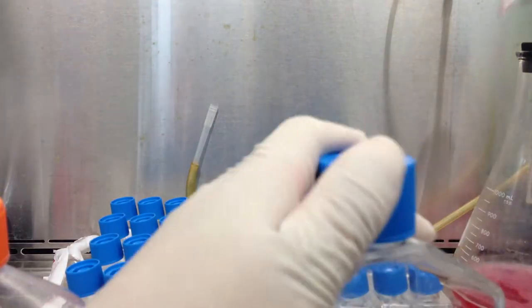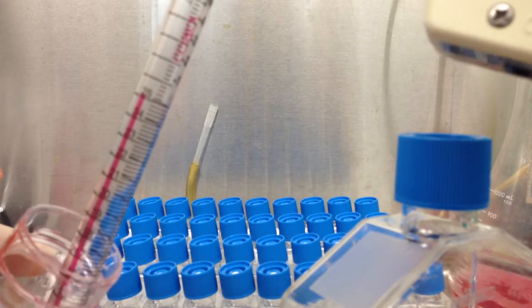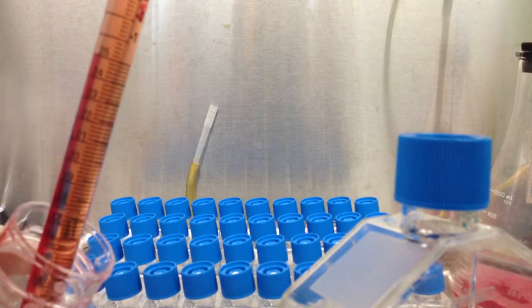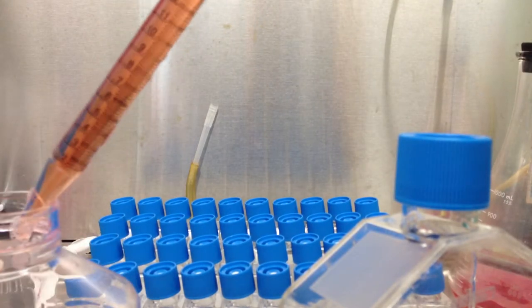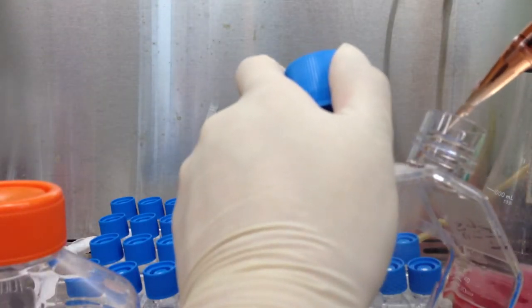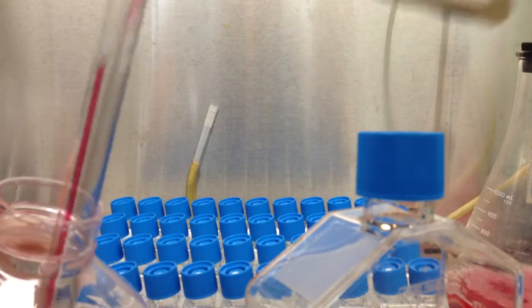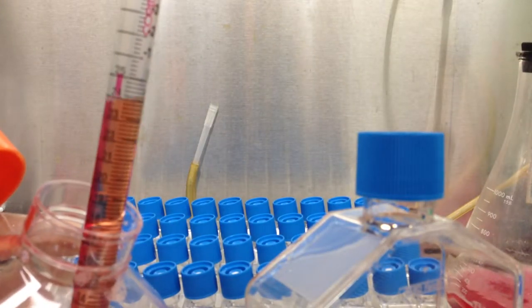And I'm gonna go to the next flask. I want to work a little bit quickly here so that the trypsin doesn't kill too many cells. And again, I'm using so much media that the 1 milliliter of trypsin will deactivate, and centrifuging is not entirely necessary. That's 30.